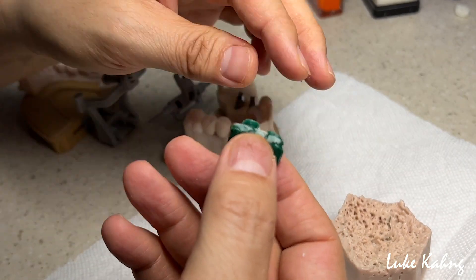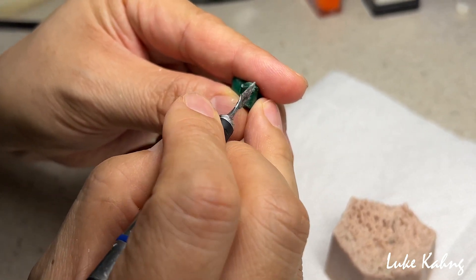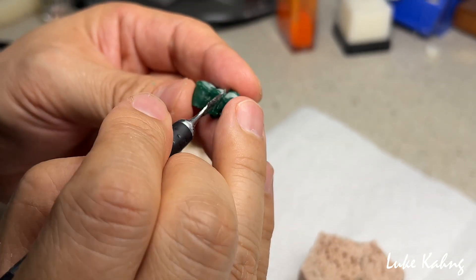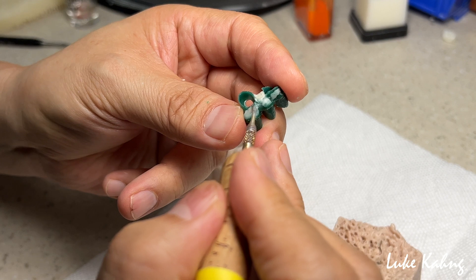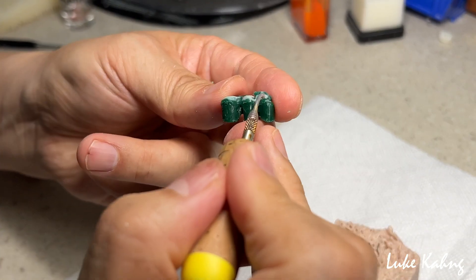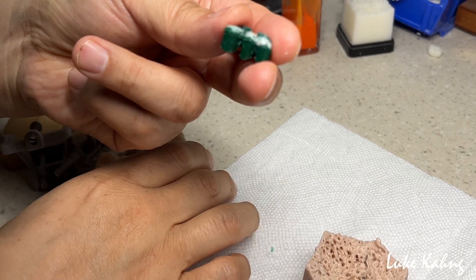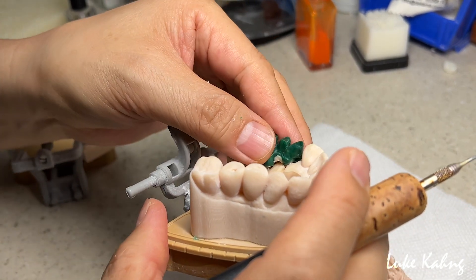The only thing is here — I don't need a lot of end, just a little bit flat down. I'm okay with that. It's a little bit soft. Now I have to add a little bit more here, then I don't get any undercut.